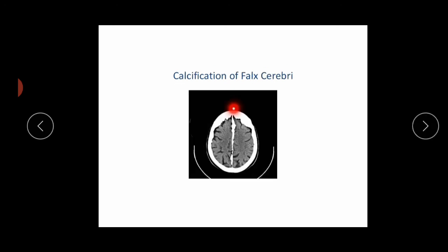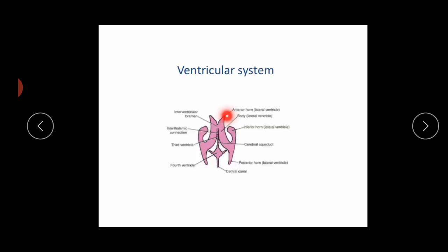This is the ventricular system. We can see the anterior horn, the interventricular foramen, and the interthalamic connection. This is the third ventricle, the fourth ventricle, the central canal, the posterior horn, and the cerebral aqueduct.